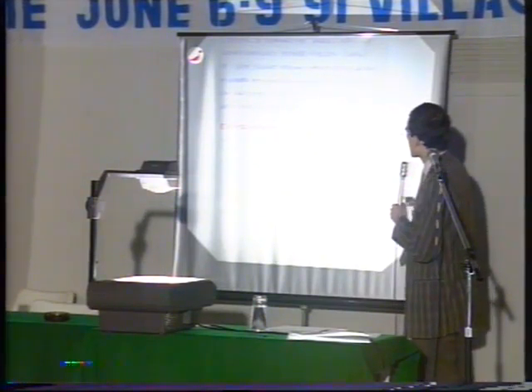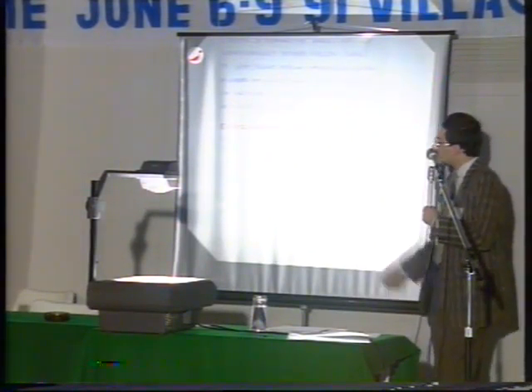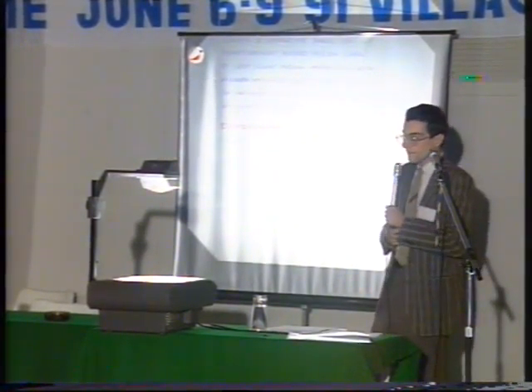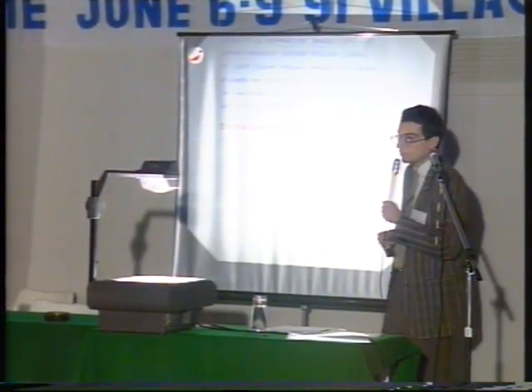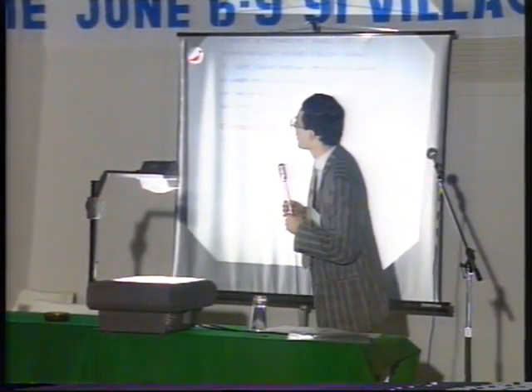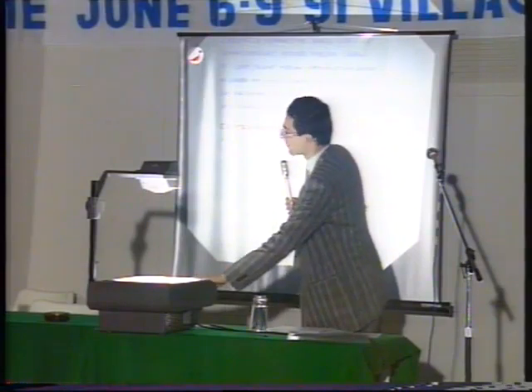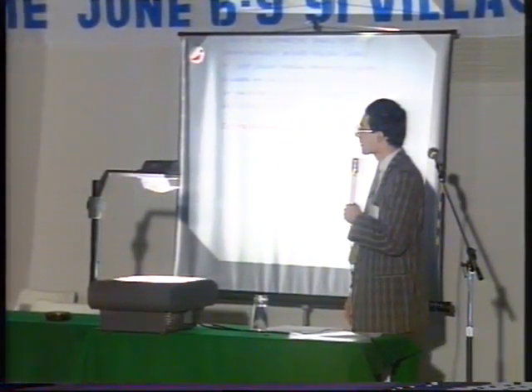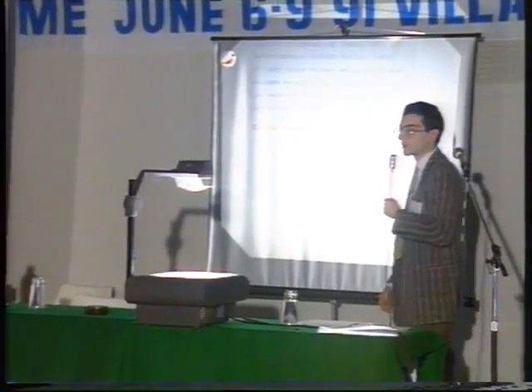So our experimental paradigm is to record these fields. These measurements are done with the 9-channel system we have in our institute, Istituto di Elettronica dello Stato Solido in Rome, Italy. I have one slide showing the system. It is a homemade system inside a shielded room.